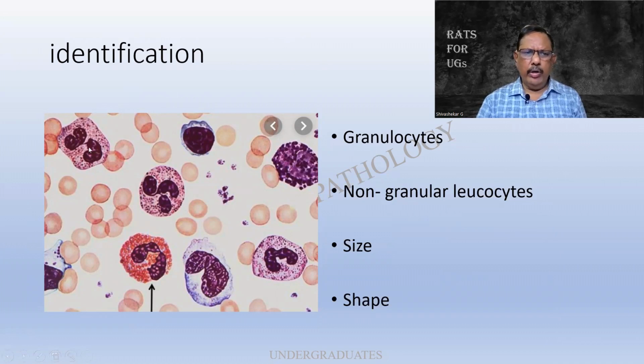So these granules are small, and the nuclei are not obscured. The granules in the case of the eosinophil are larger, brick red, and we have the bilobed nucleus for identification. The basophil, on the contrary, has coarse, large, blue granules which obscure the nuclear details. The other two friends of ours: lymphocyte, though we say smallest, is slightly larger than the RBC, the nucleus is about the size of the RBC, with scanty cytoplasm. Monocyte has a kidney-shaped nucleus, abundant cytoplasm, and is the largest of these cells.